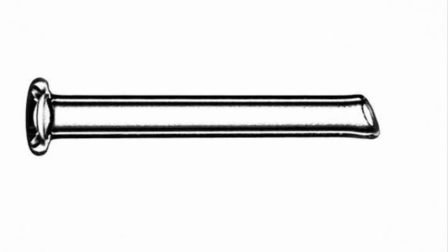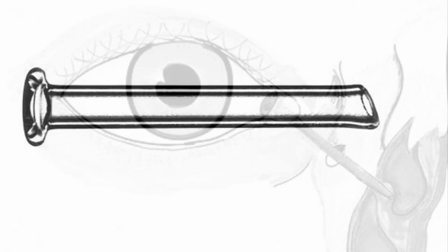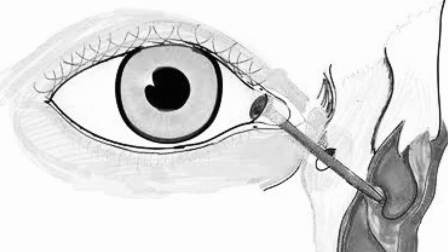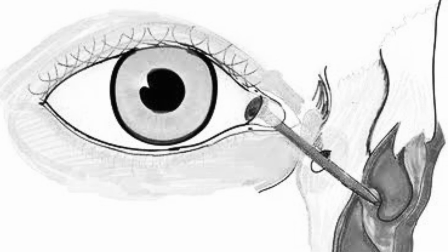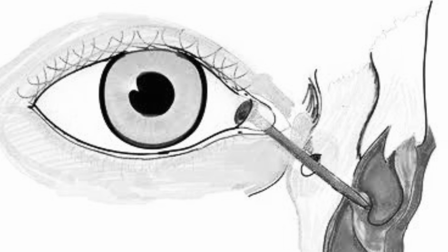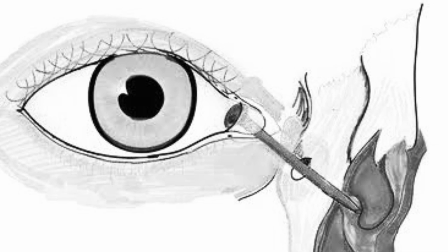These Pyrex glass tubes come in a variety of diameters and lengths, allowing customization to suit the patient's unique anatomy. The selection of an appropriately sized tube is critical to ensure that the conduit remains patent, or open, over the long term. A tube that is too small may fail to provide adequate stenting, leading to a recurrence of obstruction.